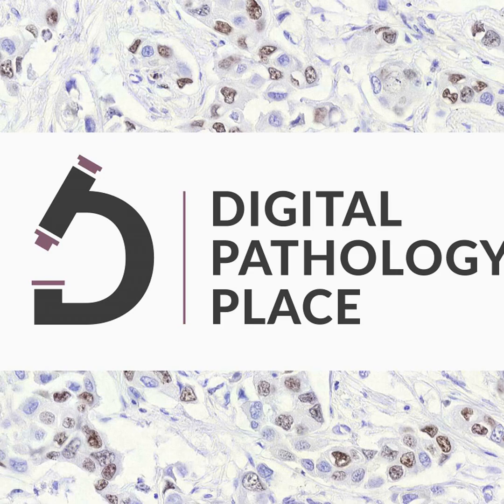So if there was no option to account for this domain shift, to account for the dissimilarities in those similar images, how similar would the samples have to be if there was no option to account for anything? It's hard to quantify that, but for a model to perform well on test images, those test images need to be from the same distribution as the training images. And so if they look quite similar, it's hard to quantify the term look, whether they appear similar.